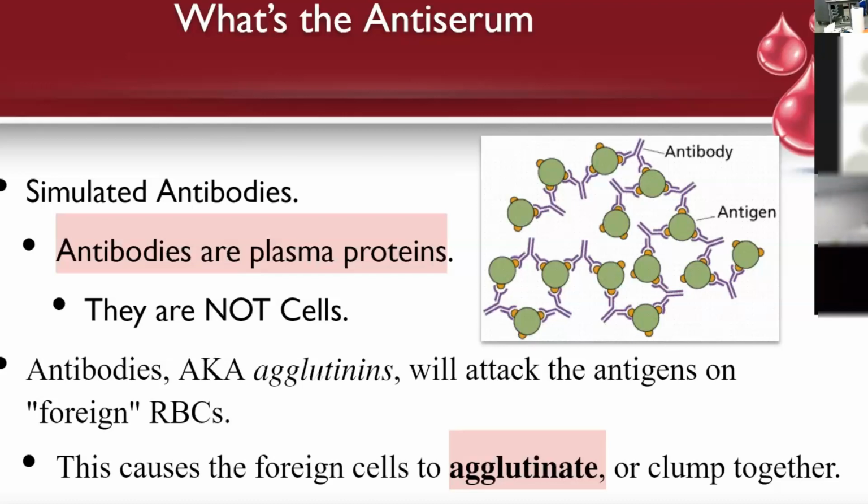Okay? So you're testing for the presence of the antigen. If it clumps, the antigen is there. So that's a positive result. You can either write clumped or positive, either one works. Okay, so this person would have A positive blood, because those are the two that clump. On the test, I will give you a sample to analyze. As long as you're reading the sample correctly, that's what we need to get out of it today. Okay, so that's the agglutination.